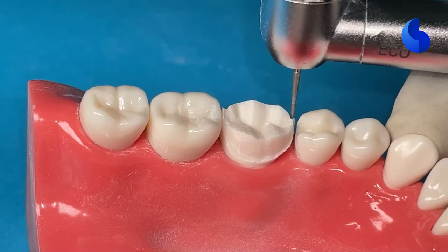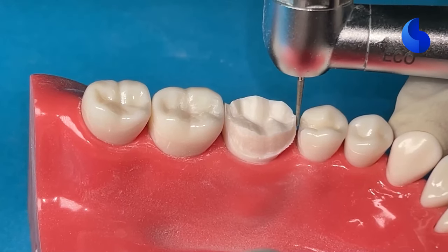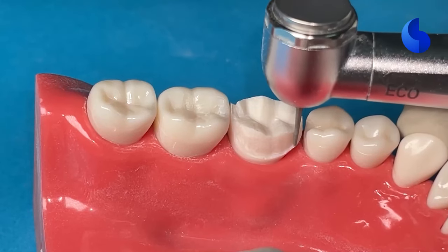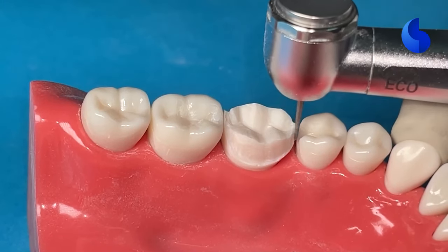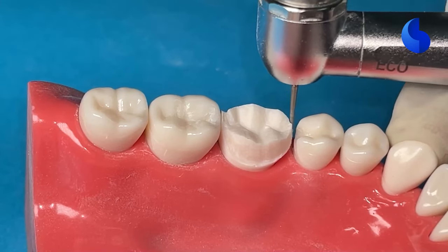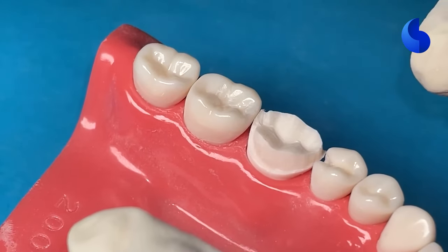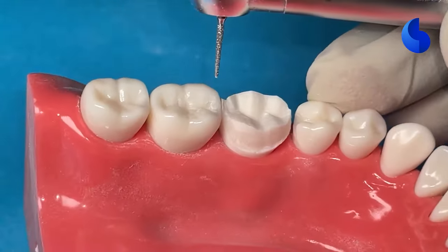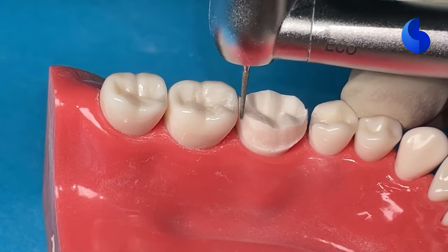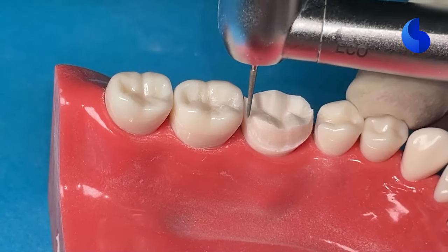So you're always keeping your burr parallel to the long axis of the tooth and then moving from one side to the other side, that is from the lingual to the buccal, seamlessly. And if you still feel a little bit underconfident in doing this, you can always use a fender wedge if that helps you and helps you be more confident in passing through this area. So once you're done with one side, you can move on to the distal side and break that island of tooth structure to achieve that proximal clearance.